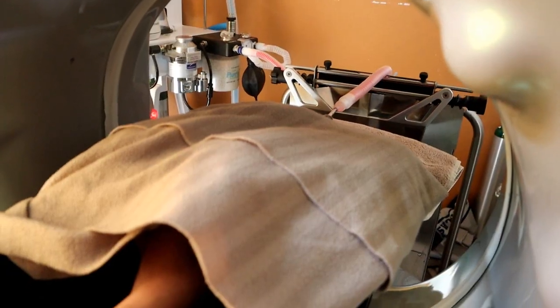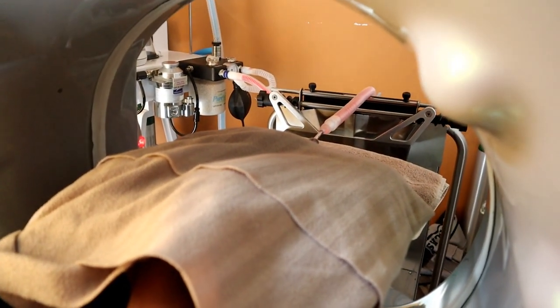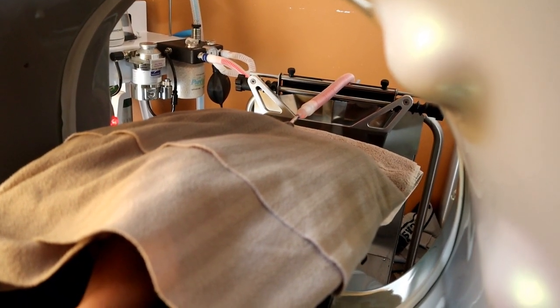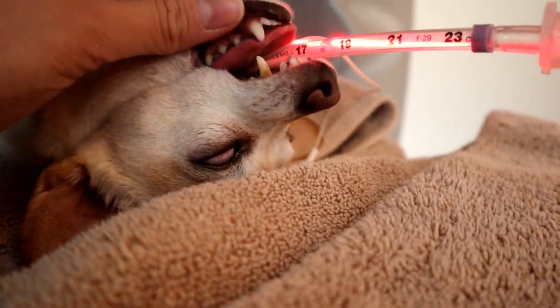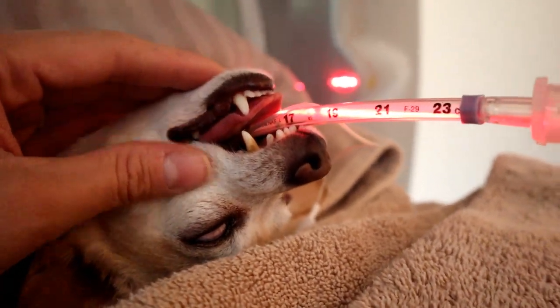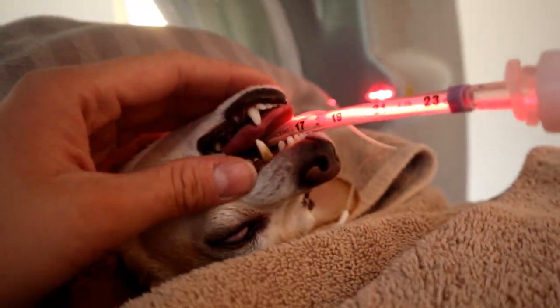We've got Izzy driving the CT machine. Riley's in there, here we go. It's only going to do 400 images and then it's going to stop and write it back. Vitals are good.